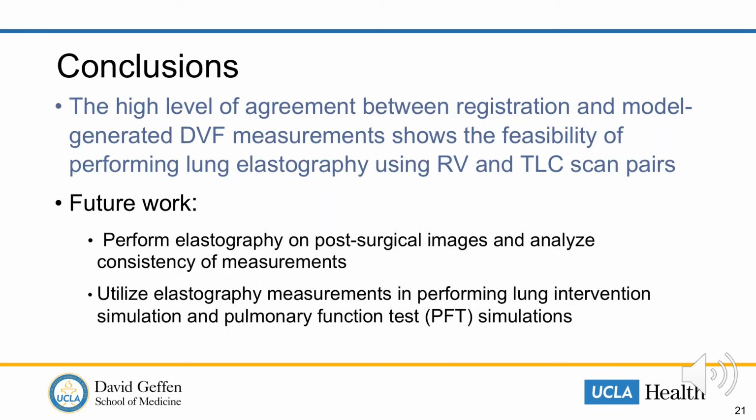In conclusion, we observed a high level of agreement between registration and model-generated DVF measurements, including displacement value convergence and Jacobian calculations, showing the feasibility of performing lung elastography using residual volume and total lung capacity scan pairs.